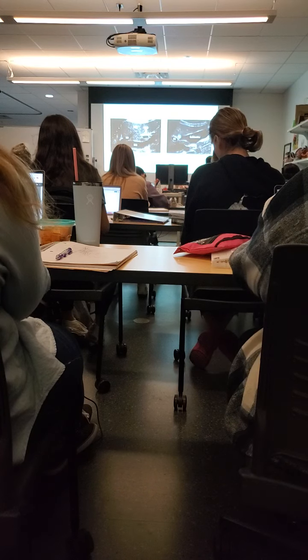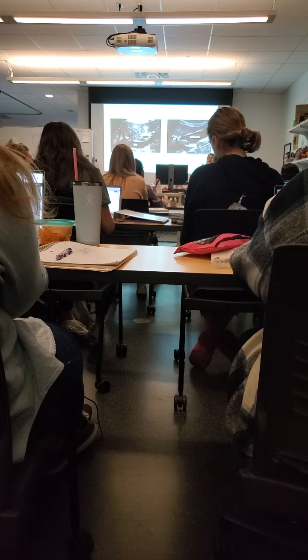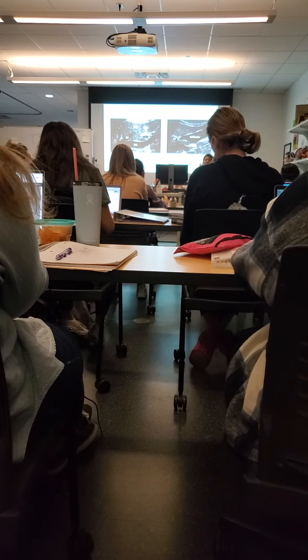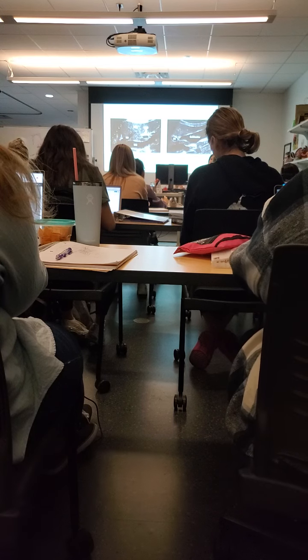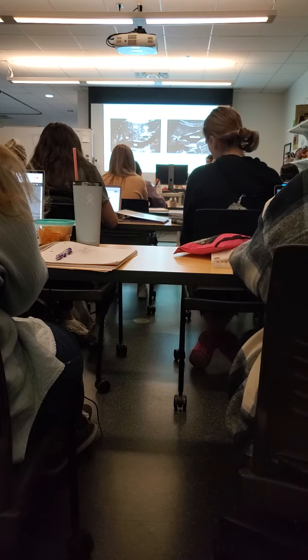Yeah. And there's a fissure right here, small, but between the gallbladder and the portal vein. Does anybody remember what that is? MLF. Yeah, main lobar fissure. Yes. Who said that? That was such a quiet little tiny voice. Oh, okay. All right, that makes sense.